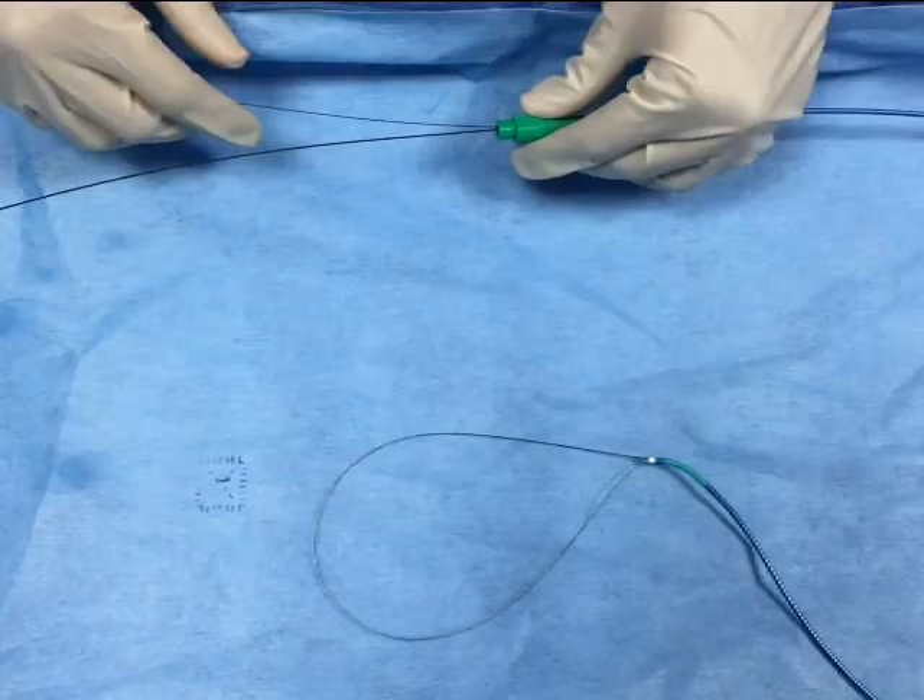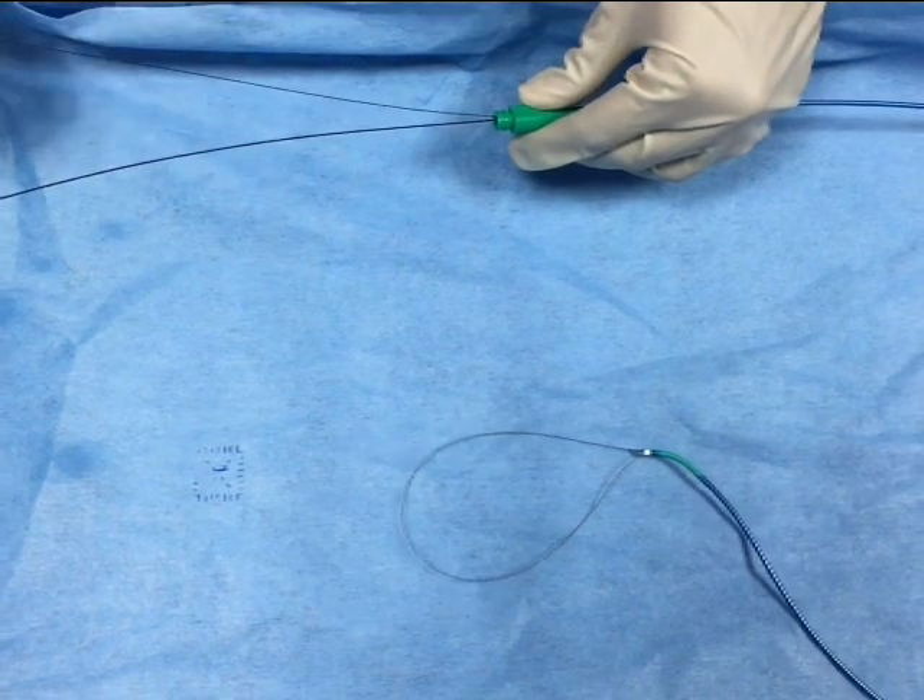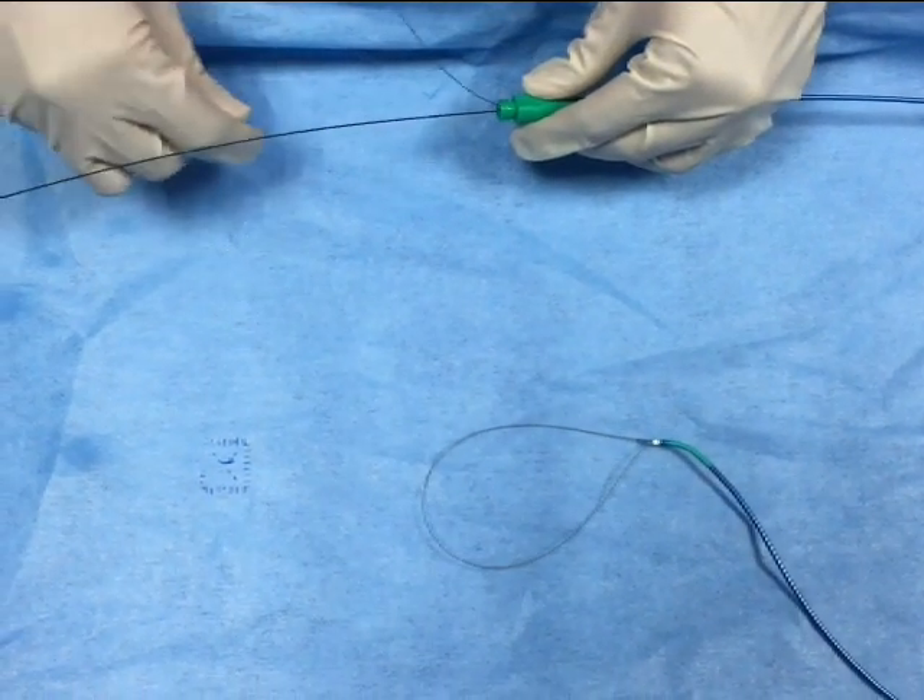One can adjust the size of the snare by manipulating the other end of the O14 wire.